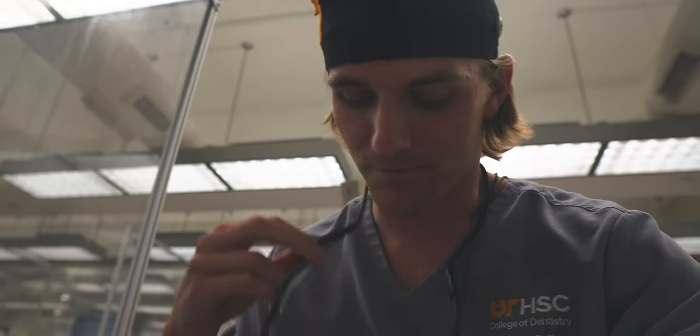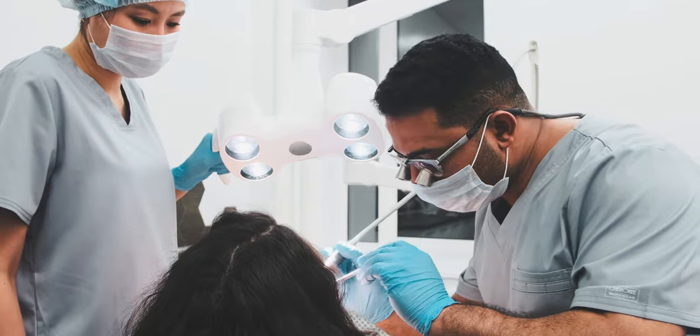The first time I wore these in lab I immediately noticed that the ergonomics were making a big difference. I really enjoyed the ability to sit straight up and do dentistry — it's just comfortable. Imagine sitting on a stool with a small back and looking down at something for hours on end. It's not a very comfortable position. These loops get rid of that, and that is fantastic.